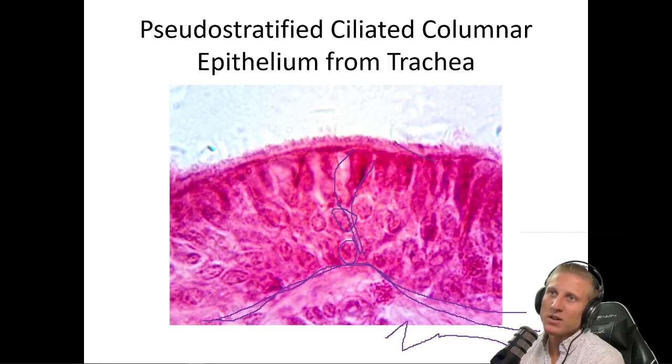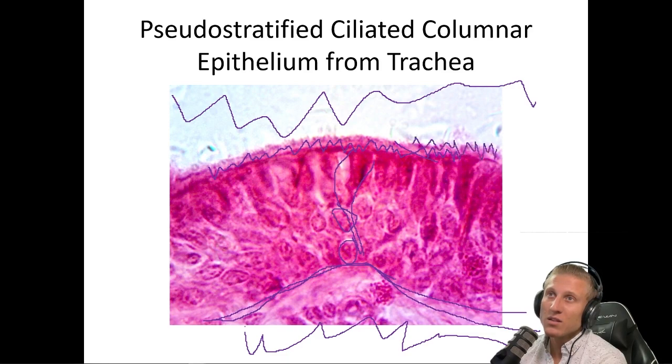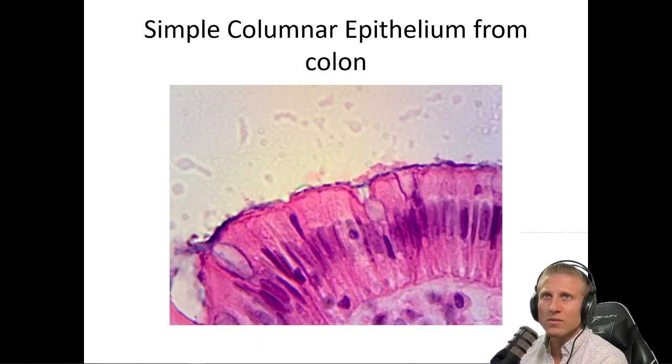And it's fairly a dead giveaway that like this space, if you're looking at it on a slide, and then you see a bunch of connective tissue here and then a bunch of empty space up here, this is probably pseudo-stratified, right? It's not thick enough to really look like a stratified, like squamous or layering process. And then lastly, a good giveaway is we see this brush border along here, right? So this is from the trachea. Yeah, so we have the cilia lining here, okay? That brush border is a good giveaway.